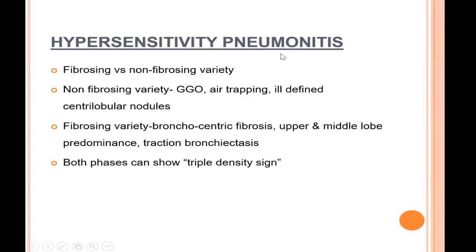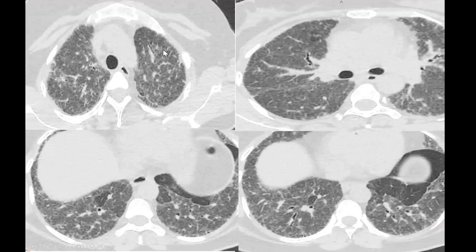In non-IPF diagnosis, hypersensitivity pneumonitis is the most common type. In initial stages it shows ground glass opacity, areas of air trapping, and ill-defined centrilobular nodules. As the disease advances, there is progressive bronchocentric fibrosis involving predominantly the upper and middle lobes. This case of hypersensitivity pneumonitis shows diffuse areas of ground glass opacity, areas of air trapping appearing as dark areas in between, and developing intralobular septal thickening and reticulations — indicating a sub-acute phase with ground glass, air trapping, and early fibrosis.